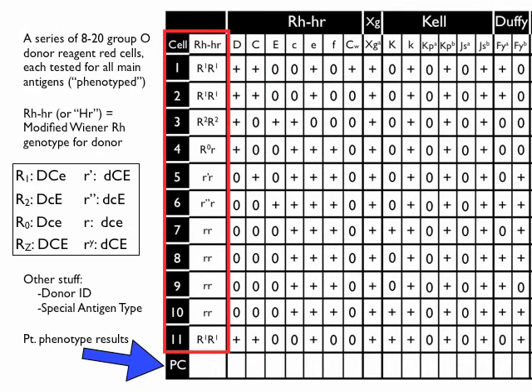We'll talk about them later, but basically that's a place where you test your patient to see which antigens your patient has present. And you'll see something that looks kind of like this. In this particular case, this patient was positive for big C antigen, that's the first plus, negative for big K antigen, that's the second 0, and then on the far right on the bottom, positive for the Duffy A or FYA antigen. Again, more on phenotyping as we go along.